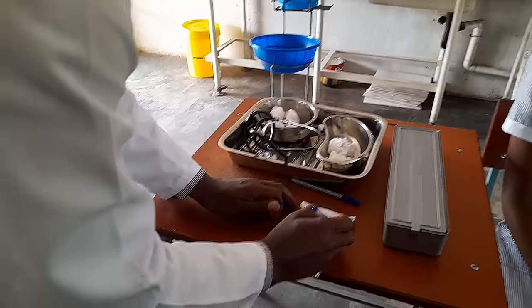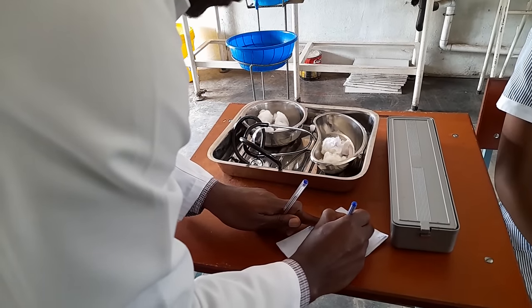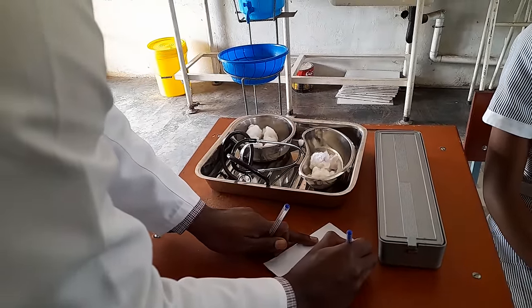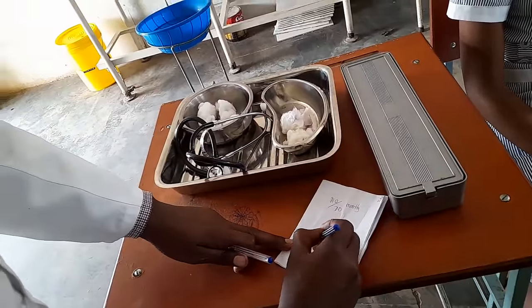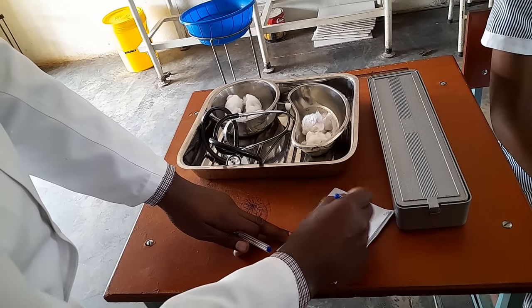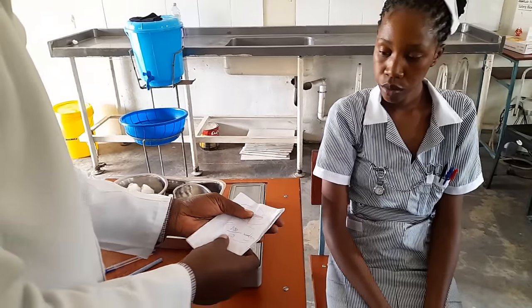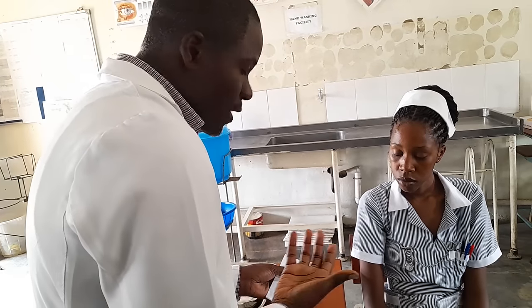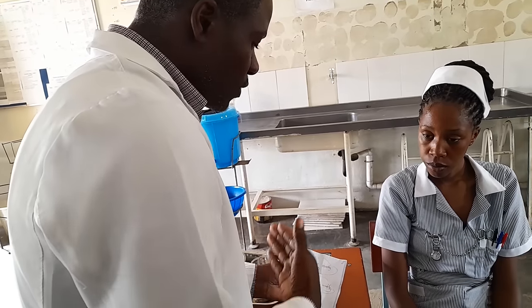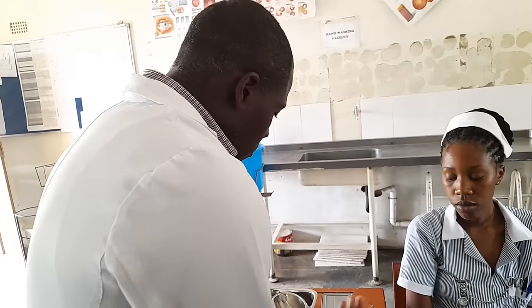Now record your BP: 110 over 70 mmHg — that's how you write the reading. Then go back to the patient and explain: 'Madam, your blood pressure is 110 over 70. All the readings are okay, meaning you're taking your medicine correctly. Keep on taking your BP medicine because they're helping the blood pressure to be normal, and in this way you're going to prevent any complications such as cardiac diseases. Thank you very much for allowing me to do blood pressure.'